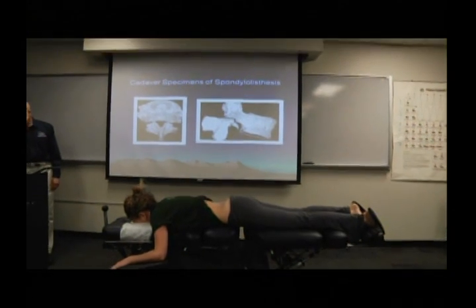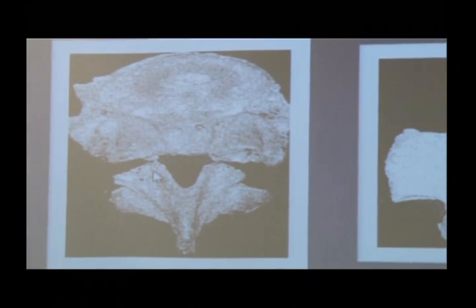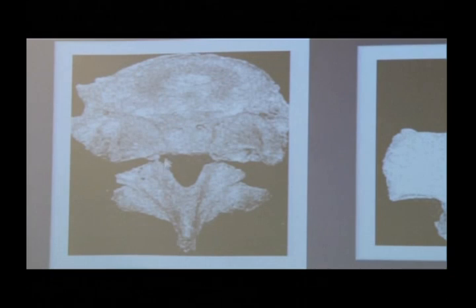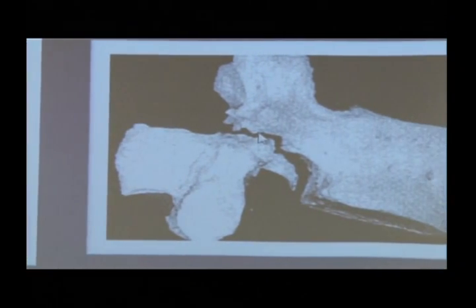Usually there are fibrous adhesions that are holding what's left of the articular columns and the lamina and the spinous, and this just does not need to be messed with. It's already an unstable segment by its nature, and we don't want to go in and create more instability. So we go directly above.